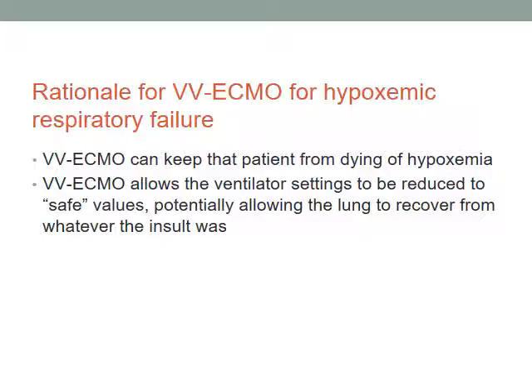Now, why would this be something worth doing in this population of patients? What's the rationale? Well, the short-term answer is only part of it. The short, obvious answer is, well, it keeps you from dying of hypoxemia. So if you've got horrendous hypoxemic respiratory failure, I can provide oxygen and you don't die of hypoxemia. That's great. But what's really important, we think, is that we can turn the ventilator down to safe settings. Don't forget, to keep these people alive with bad ARDS, we have to do a lot of things that are basically damaging to the lungs. We use pressures and volumes that damage the lungs. We use high FiO2, that damages the lungs.